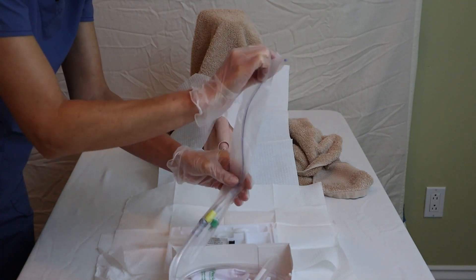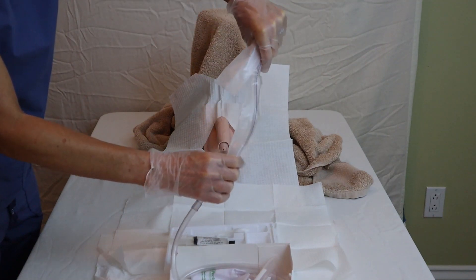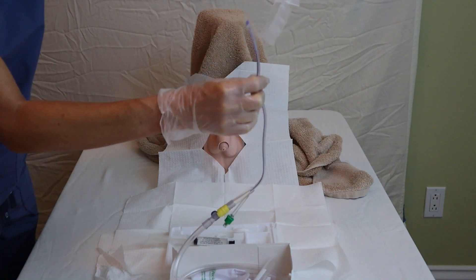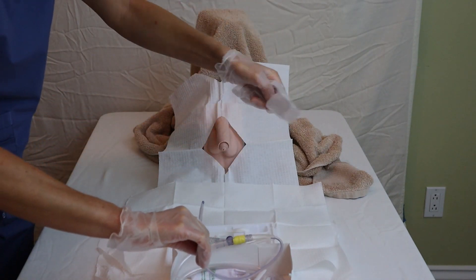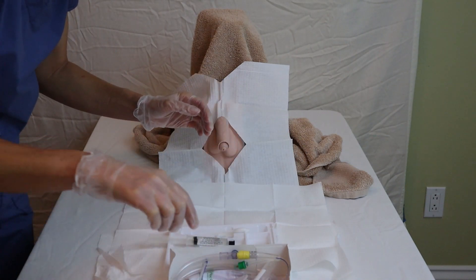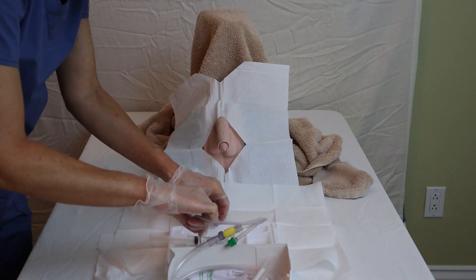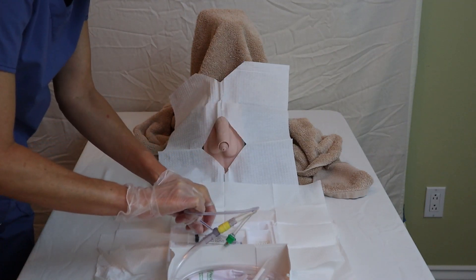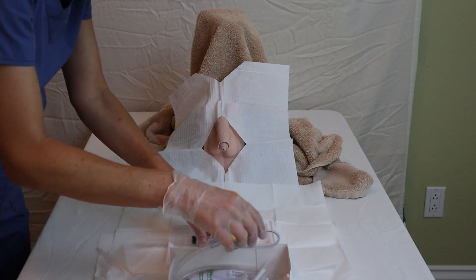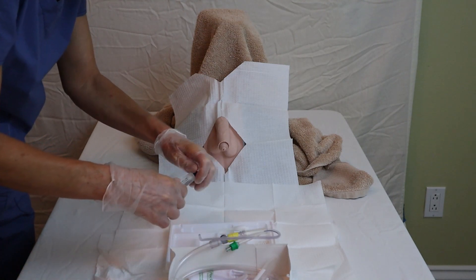I place the lubricant on my tray, then the lubricant packaging goes in my trash pile. The catheter tends to be pretty flimsy in the box, so you want to make sure it doesn't touch anything. Sometimes you can slide it out easily, but make sure that you hold on to the wrapper and the catheter because it has a tendency to flop and could end up somewhere on the bed and no longer be sterile. I get rid of the wrapper, then take my catheter tip and place it inside the lubricant at least one to two inches, making sure it's well lubricated.